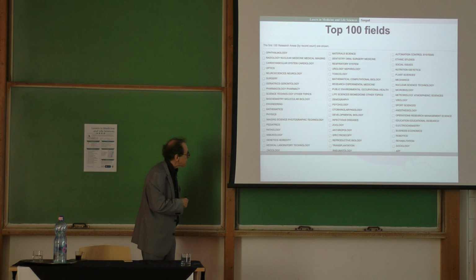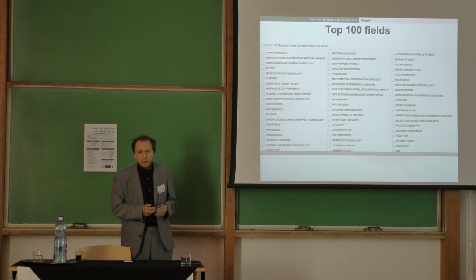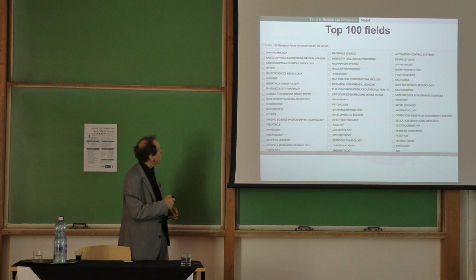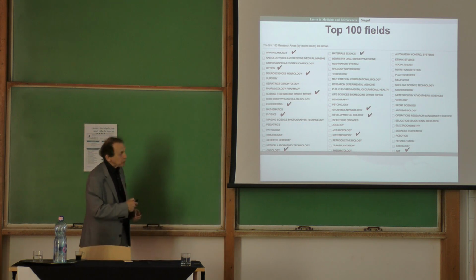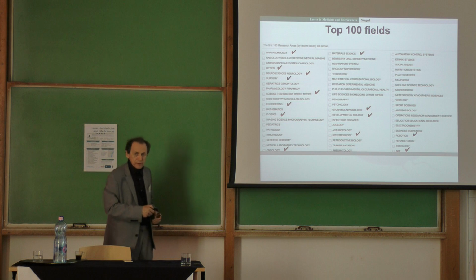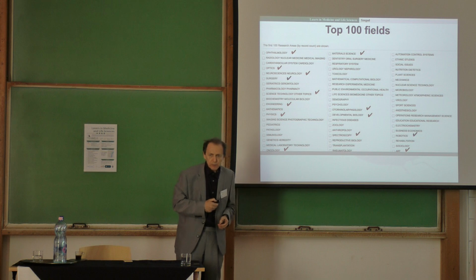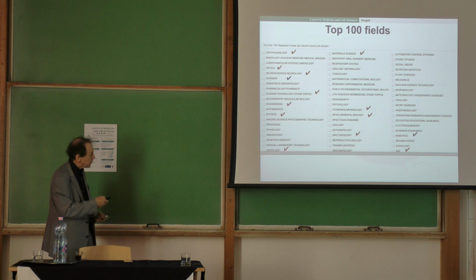This is a list of topics from Web of Science where they've been touched by OCT. So you see here ophthalmology, cardiovascular, public environmental, occupational health, microbiology. So what we did in Kent, we looked at all this, and now recently we look at surgery and robotics. There is an interest in mounting OCT instrumentation on robotics, robots being used in surgical interventions.